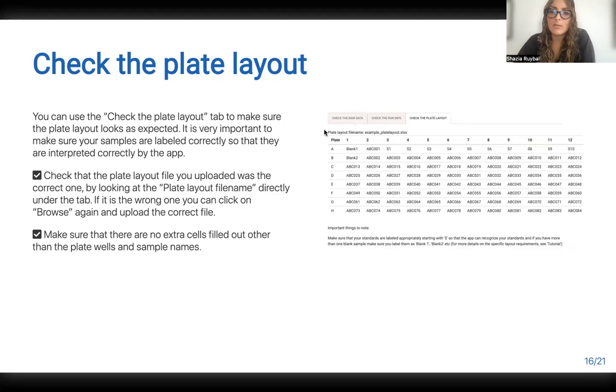So I've just included this for all of them. And again, make sure that there are no extra cells. If suddenly I see a note, or extra columns, then I know that I need to go back and fix my Excel file, because the application won't actually process the data correctly. Any questions at this stage?